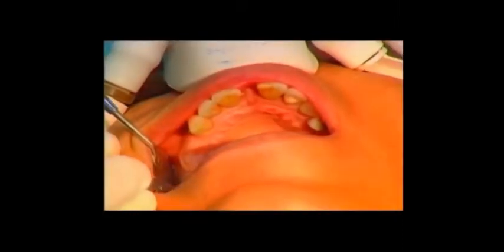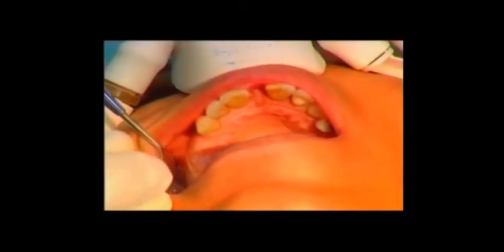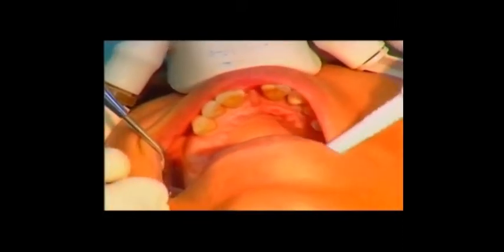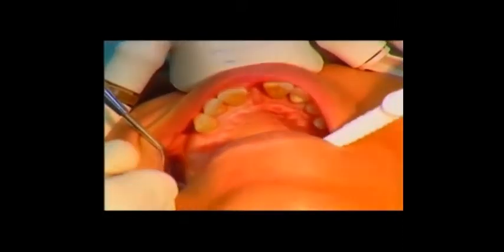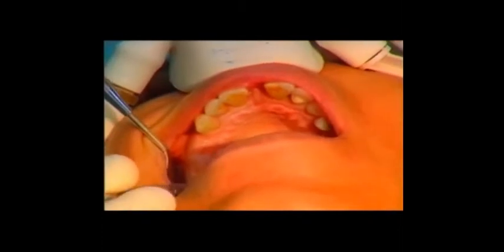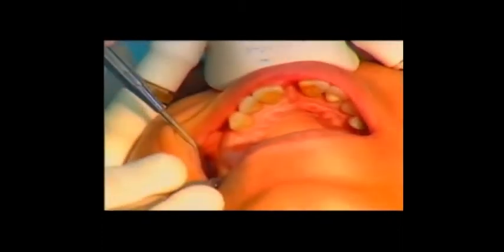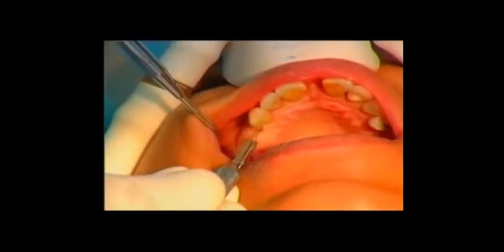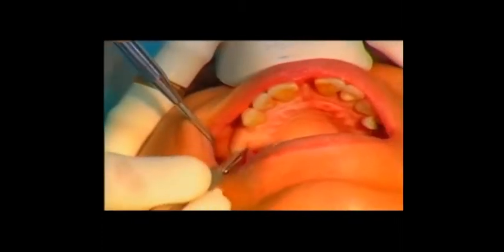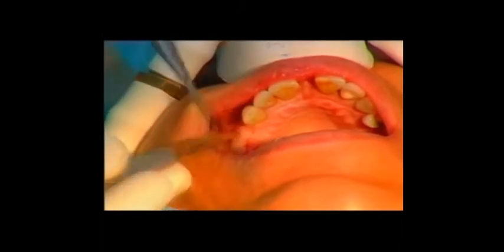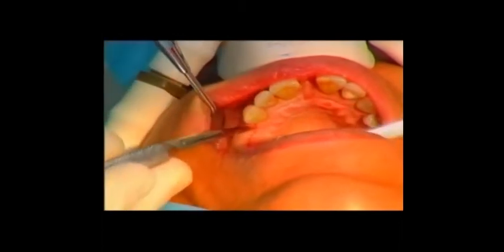A horizontal full thickness flap with palatal bias is raised, starting from the tuberosity region to the distal line angle of tooth 13. A small vertical incision is made to expose the alveolar crest.